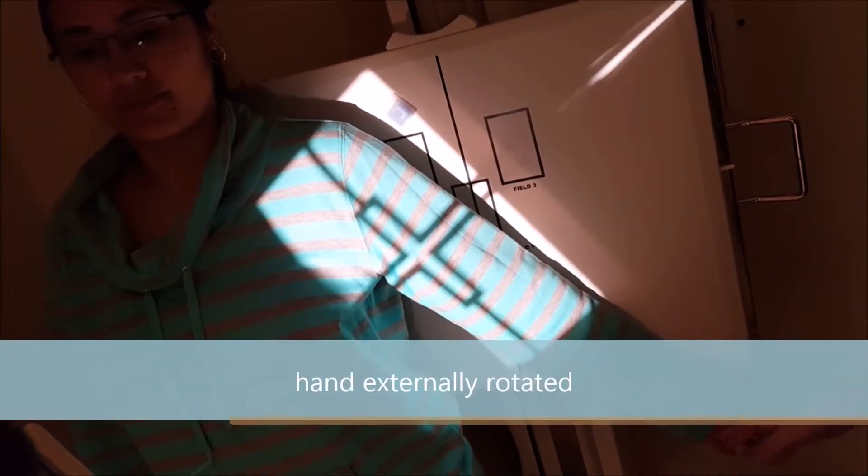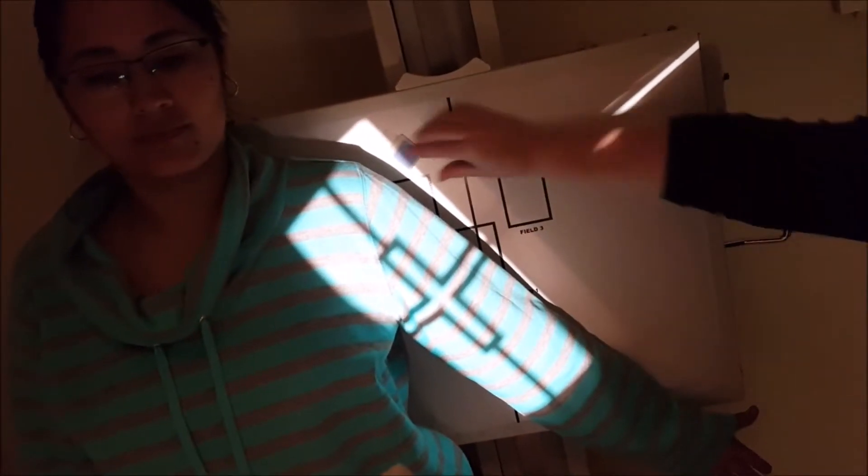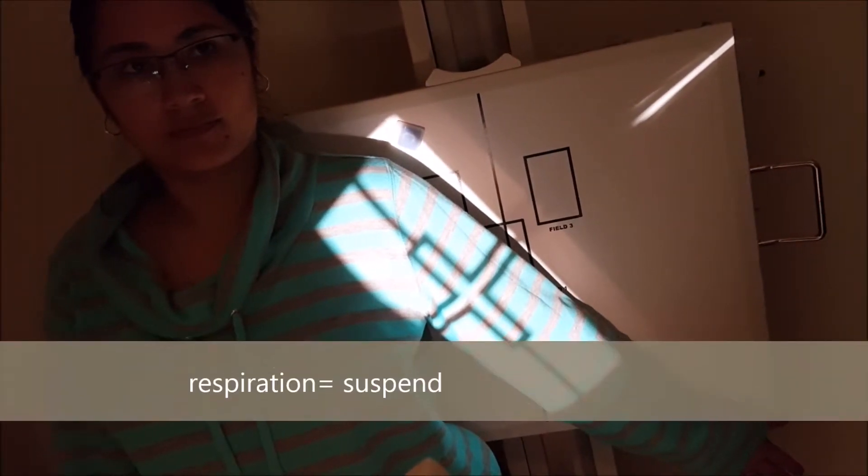On this one you want the hand externally rotated in a supinated position. You're going to include the shoulder and the elbow. You're going to increase your collimation so you just have a little bit of light on the inside and outside — just leave enough room for your marker. The respiration for this one is suspended.